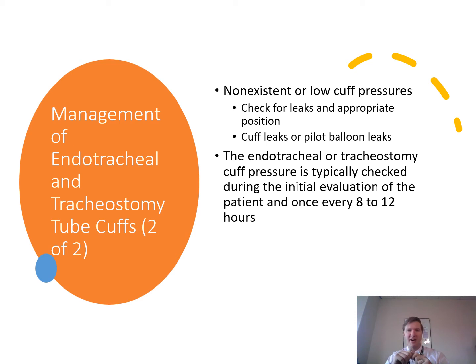What about tube and mouth care? Tube and mouth care is something that we have to worry about. Once every shift, usually, the ET tube should be repositioned in the mouth and retaped if needed. Repositioning the ET tube helps prevent pressure injuries to the gums, the mouth, the lips, or nose that can occur as a result of constant pressure of the tube. Oral hygiene should also be performed routinely. Although oral hygiene typically is the responsibility of the patient's nursing staff, a lot of respiratory therapists are involved in this as well. Retaping and repositioning the tube is usually a 2-person procedure. One practitioner holds the tube in place while the other secures the tube with surgical tape.